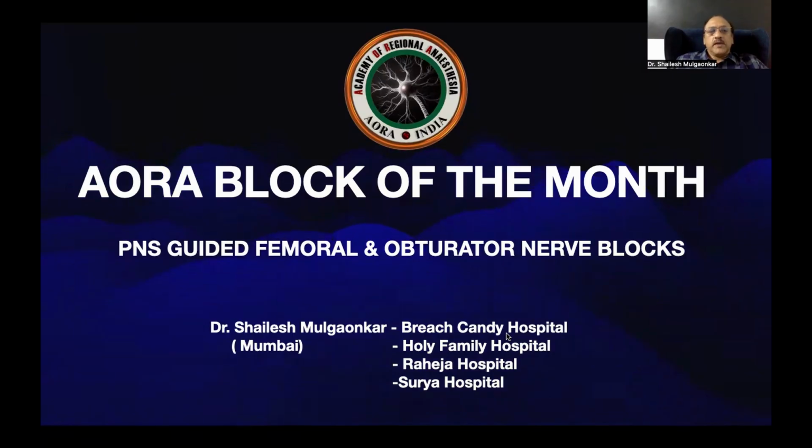Today, I'm going to talk about PNS guided femoral and obturator nerve blocks.